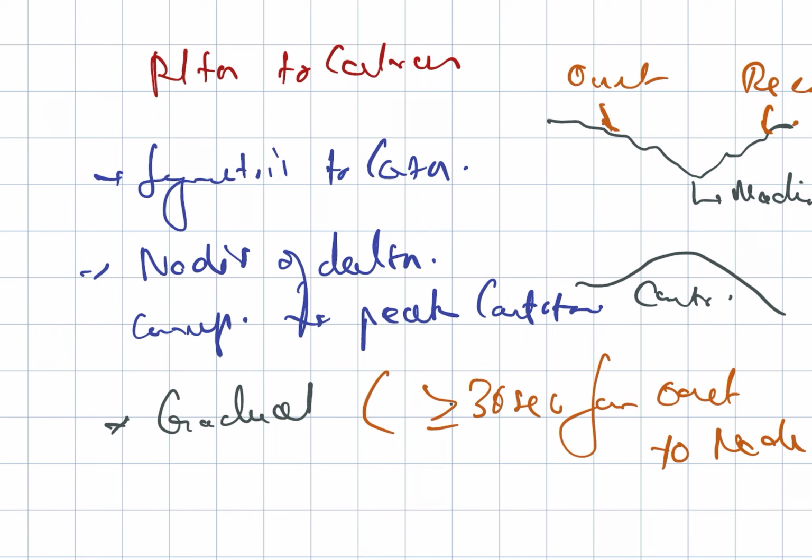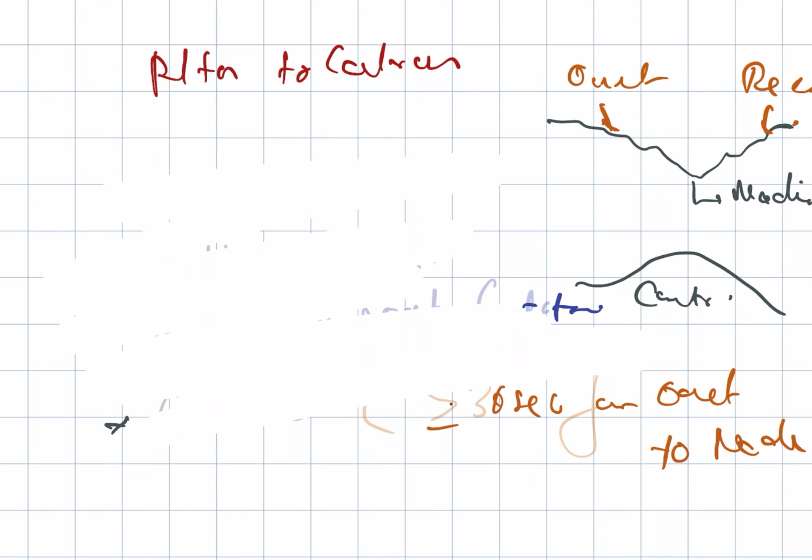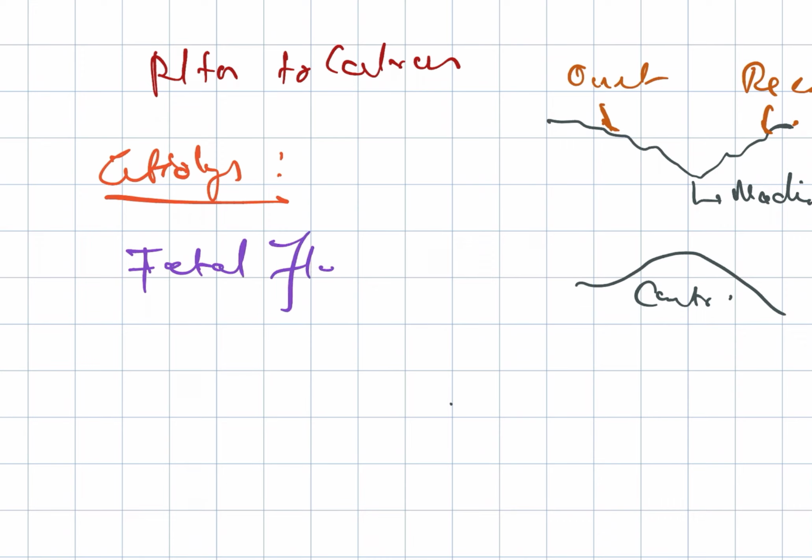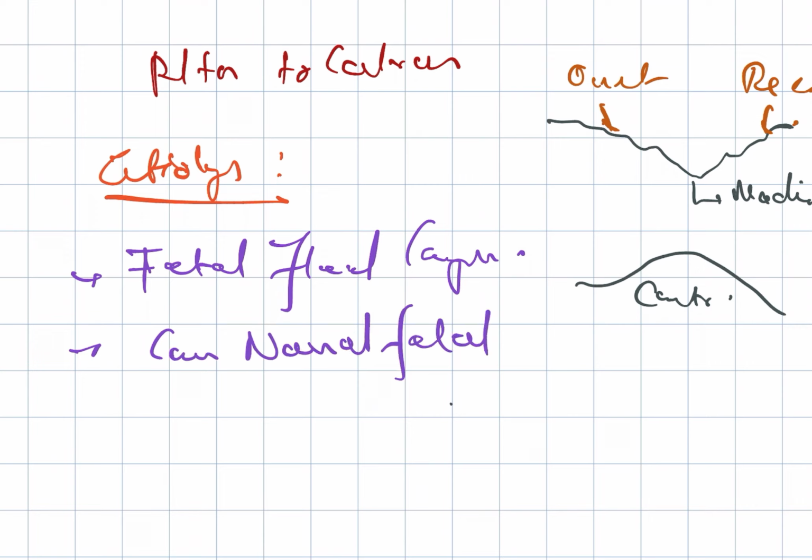So here, looking at the etiologies which are responsible for this condition. Etiology is nothing but the fetal head compression, as well as it can be normal fetal tracing.